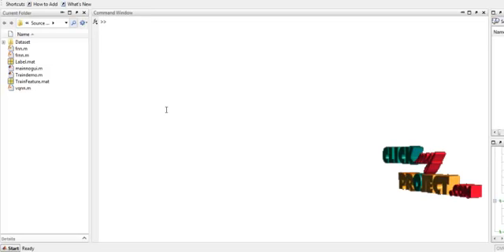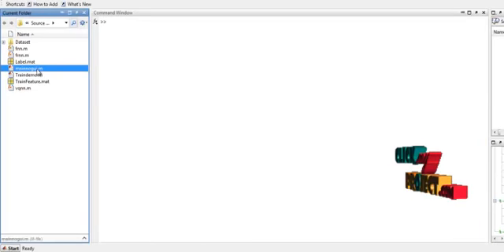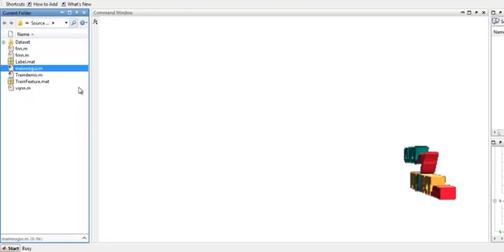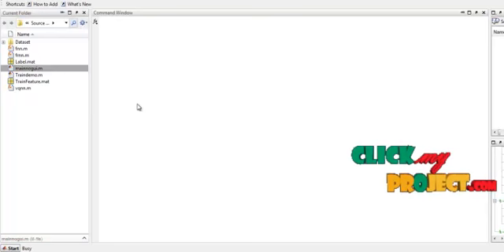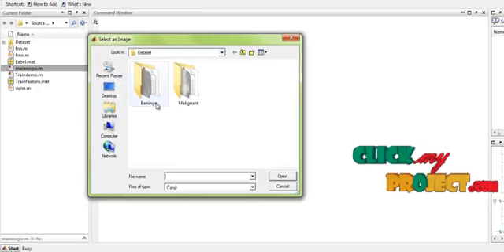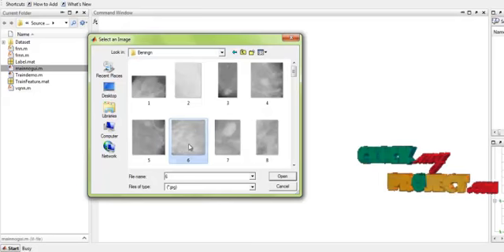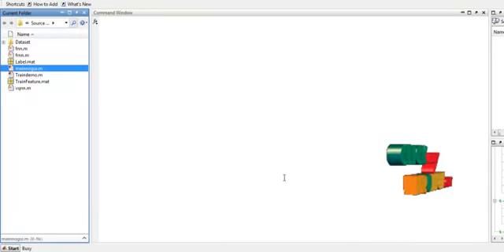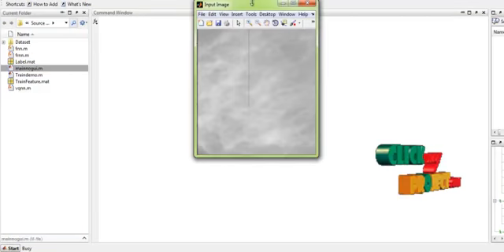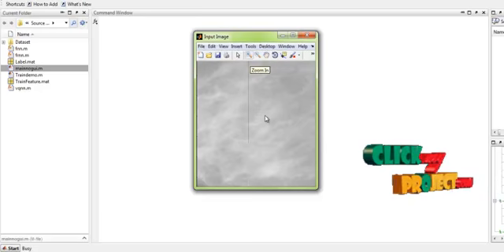Let us see the running procedure of the process. To run the code, select the file 'main' which is present in the source code folder, right-click it and click on 'Run File'. You will get the process executed. Select any one of the images present — either benign or malignant — as both contain some microcalcifications. After selecting the input, the input image is displayed.